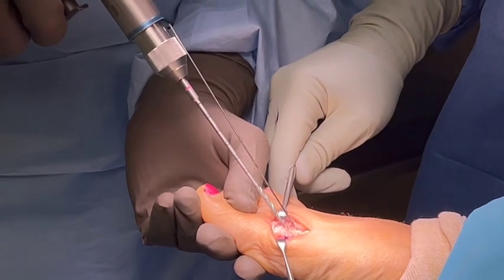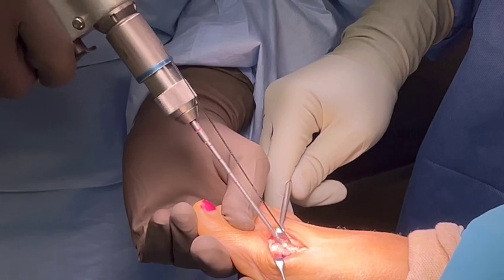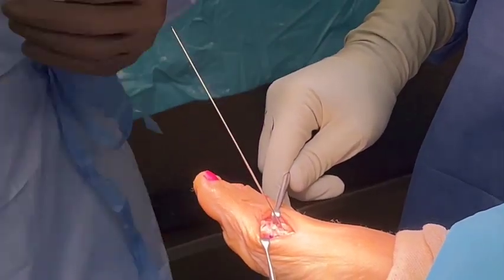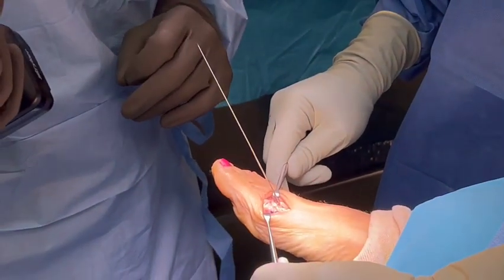Right here, we're going to go ahead and drill out the area, get ready for the screw. Real simple. And then we've measured it out — it's going to be an 18 or 20.